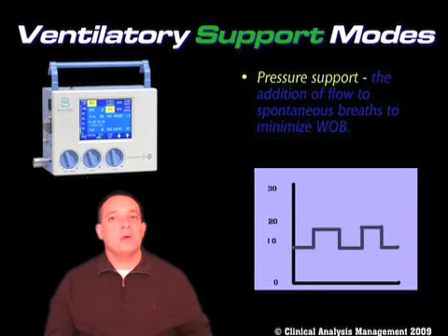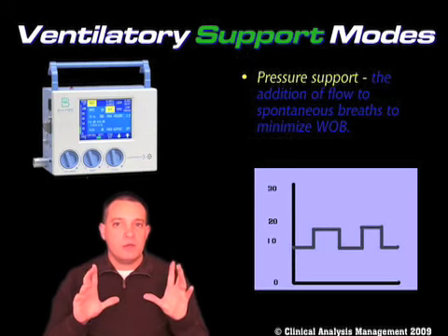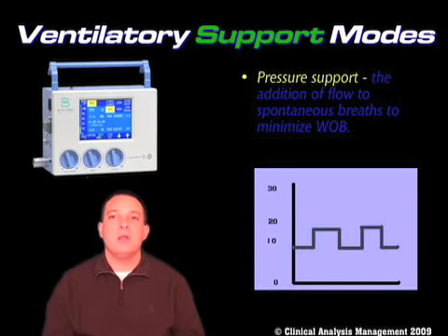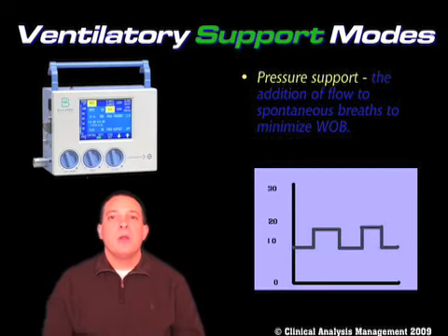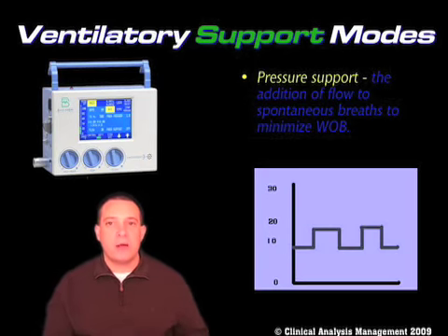So remember with SIMV, we said there were 2 kinds of patient-driven breaths. There was a breath inside the window, and if they were inside the window, then the ventilator just says, oh, you're taking a breath, so here's your full-on breath. In contrast, if there were breaths outside the window, we said that the ventilator was not going to give a full-on ventilator breath. Well, with pressure support, we have kind of a halfway in the middle kind of thing. That's probably the best way to describe it.